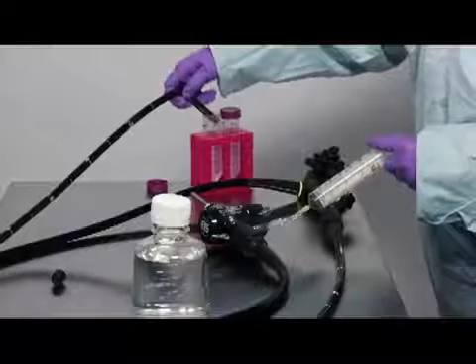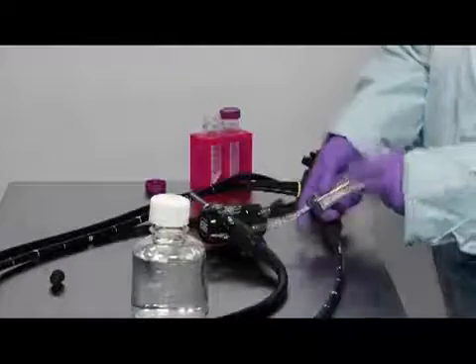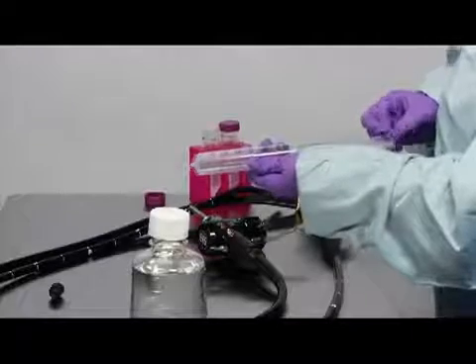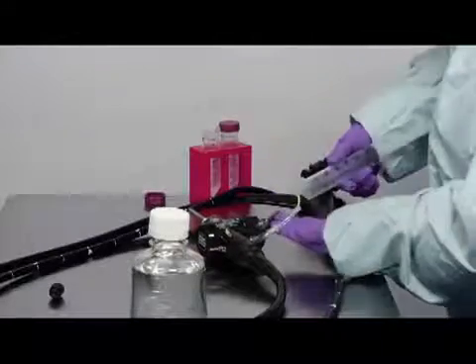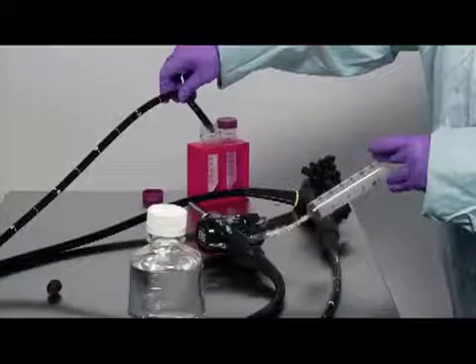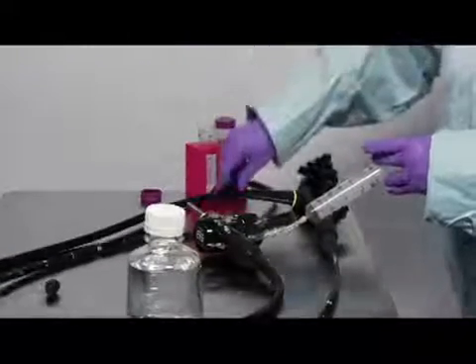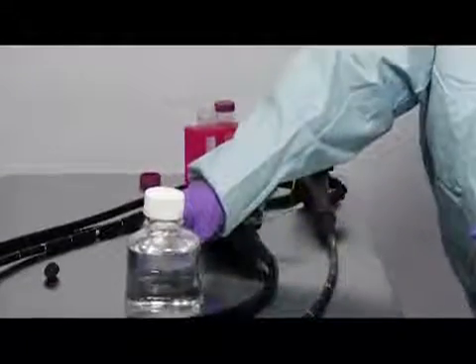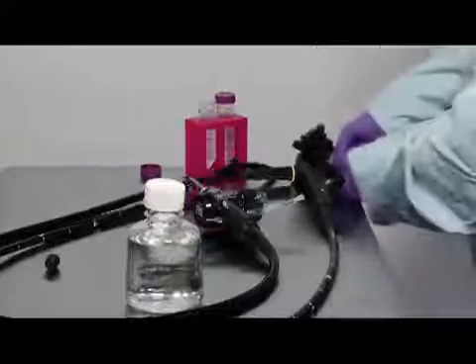Same as the last procedure, you want to remove the syringe, pull back to 60 cc's to get air to push the rest of your sample through to the sample collection tube. And this completes your sample collection for the alternate protocol.